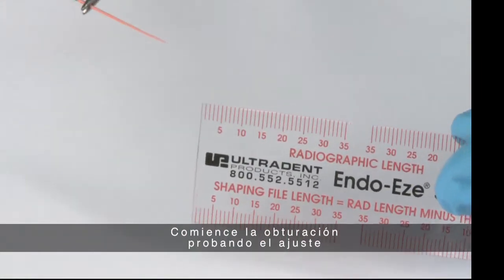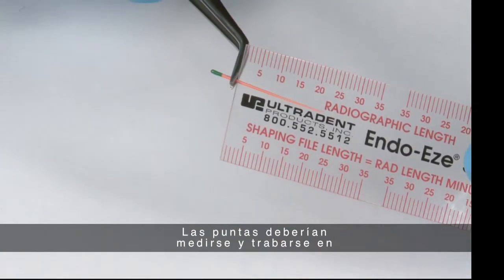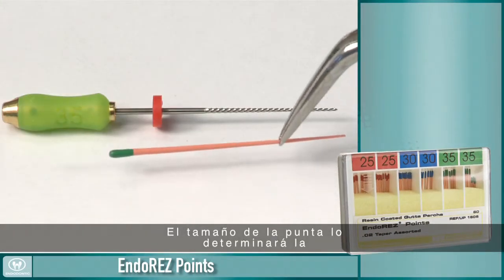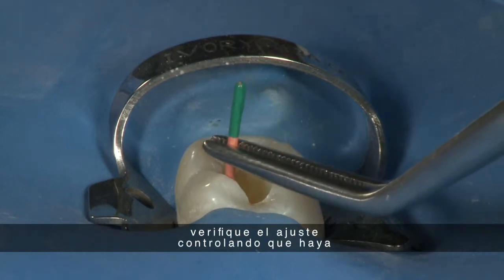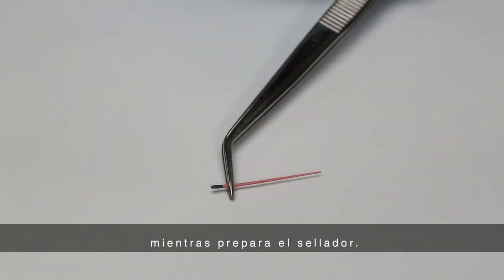Begin the obturation process by trial fitting an EndoREZ point into the canal. This point should be measured and locked into cotton forceps at the pre-instrumented length. The size of the point will be determined by the last hand file used for apical enlargement. After gently sliding it to length, verify the fit by checking for a gentle tug back when removing the point. Lay the master cone aside while preparing the sealer.